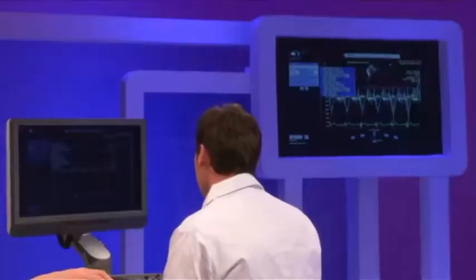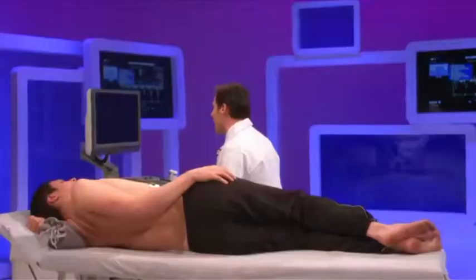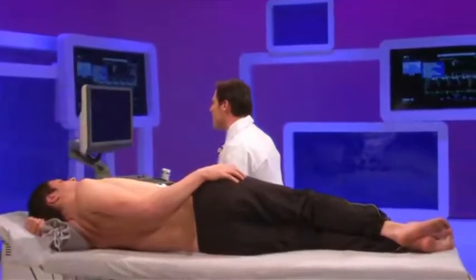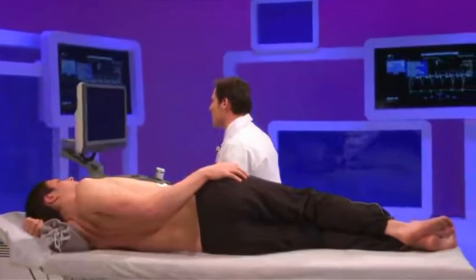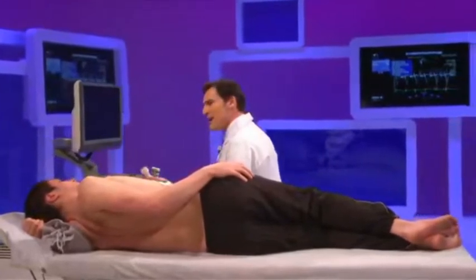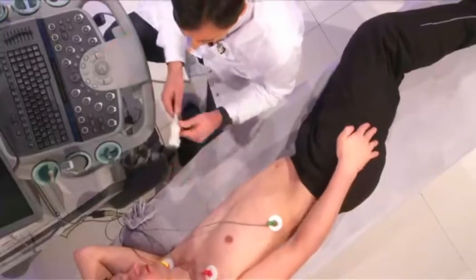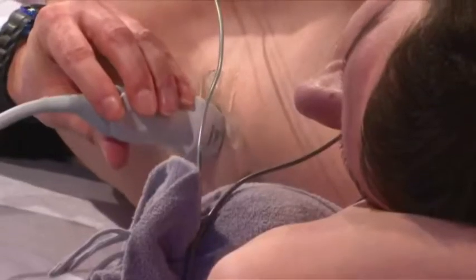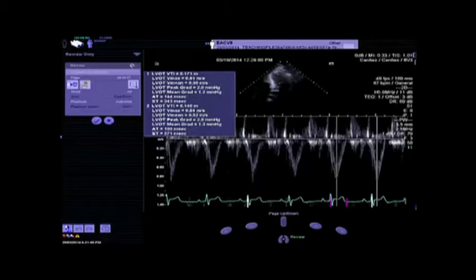So now let me finish this presentation with the important part, that is the assessment of the consequences on the left ventricle. So for doing so, I will again start with the parasternal long axis view, and I have acquired this image. Maybe I can also try to have this image in my thumbnail.